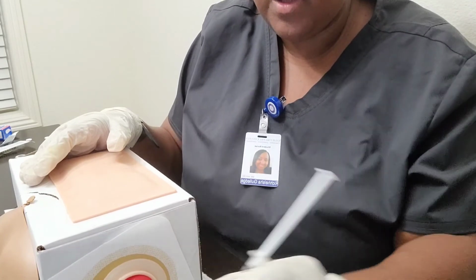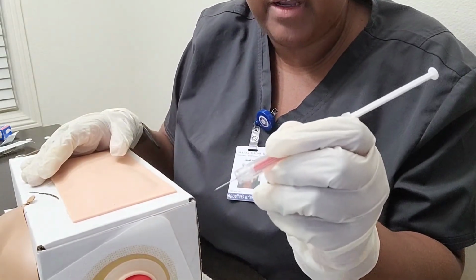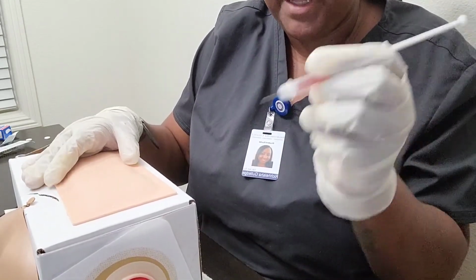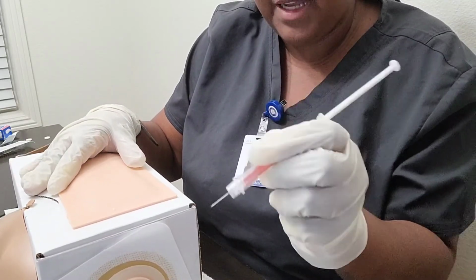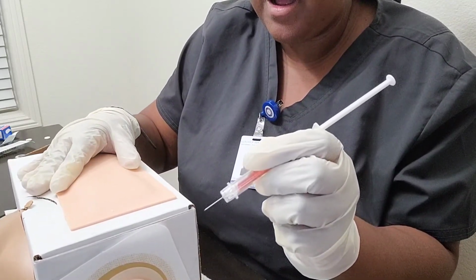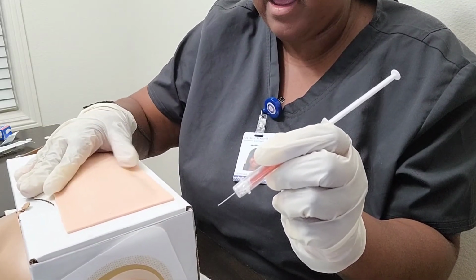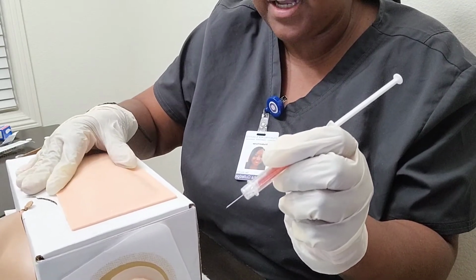Okay, so I'm going to go ahead and hold the syringe between my thumb and forefinger as my dominant hand, like a dart, and then I'm going to, with my non-dominant hand, hold the skin across the injection site, like pinch it.